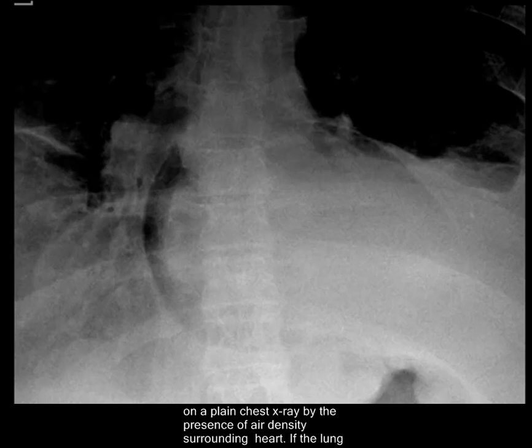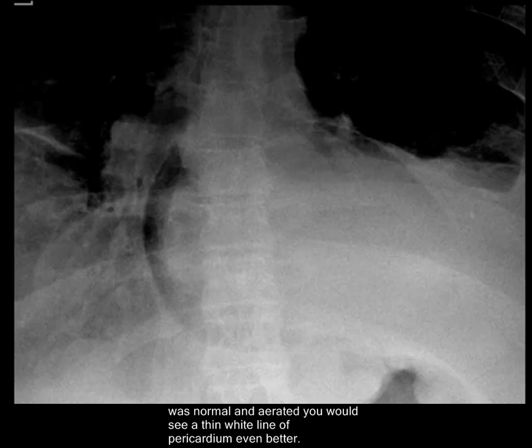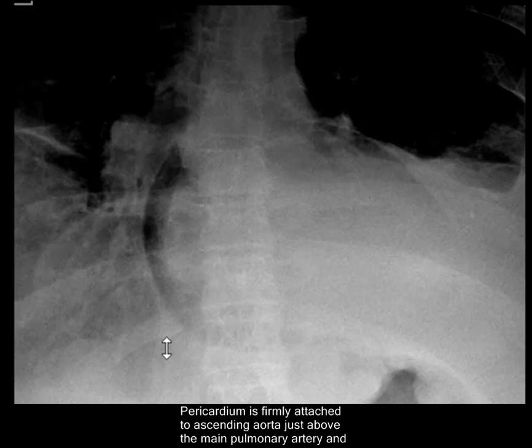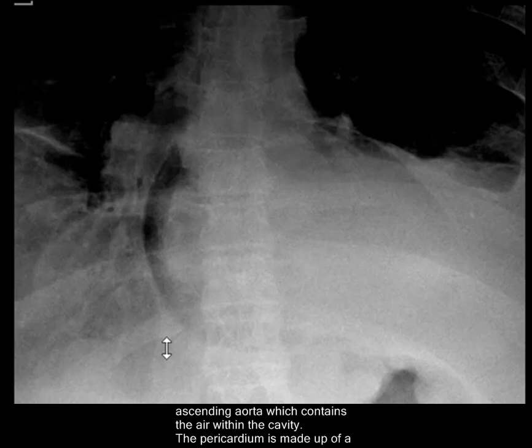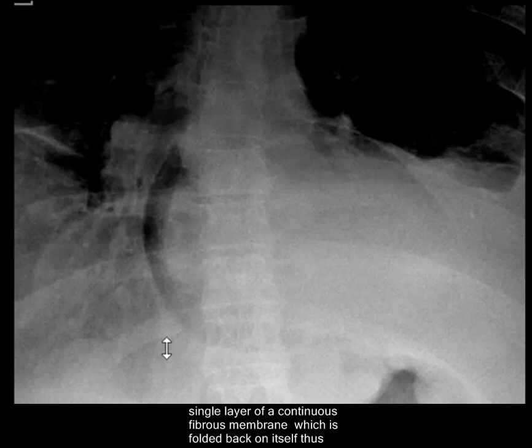If the lung was normal and aerated, you would see the pericardium even better. The pericardium is firmly attached to the ascending aorta, just above the main pulmonary artery, which contains air within the cavity. The pericardium is made up of a single layer of a continuous fibrous membrane, which is folded back onto itself, thus making two layers.